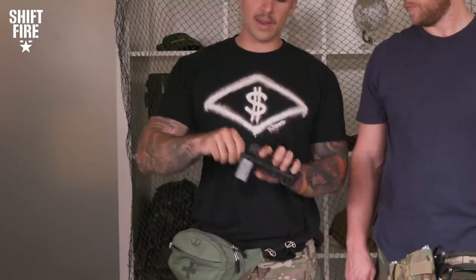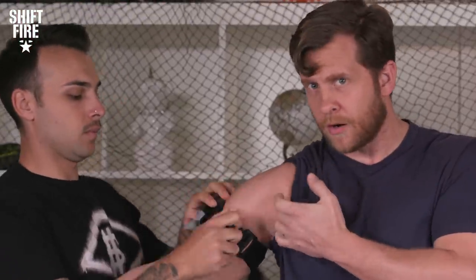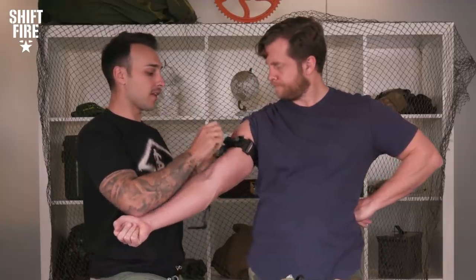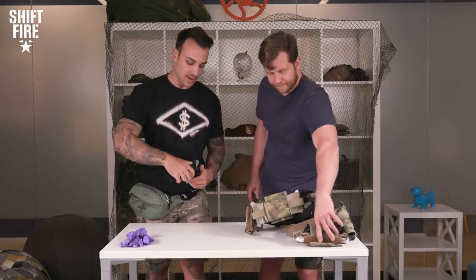How you store your tourniquets is going to be extremely important. If you put a tourniquet in your IFAK still wrapped in plastic with the label on it, you're doing something wrong. You want to eliminate as many steps as possible so you can just pull it out and use it extremely fast. Say you have a massively muscular arm — you put it on there, twist, twist, twist until the bleeding stops. That's how fast it can work — just a couple seconds. Massive hemorrhaging will kill you in less than three to five minutes. Tourniquets should be the easiest thing to access in your IFAK — if you keep it inside, keep it right on top.